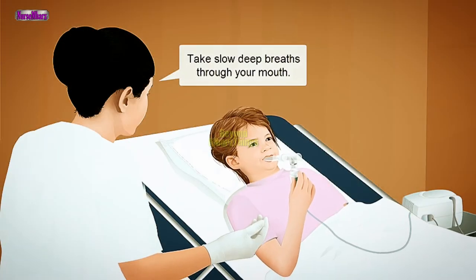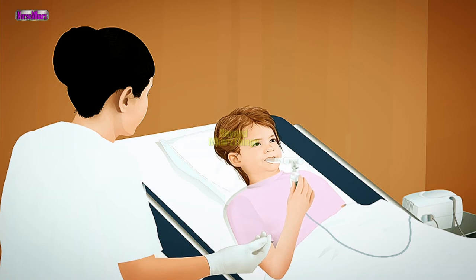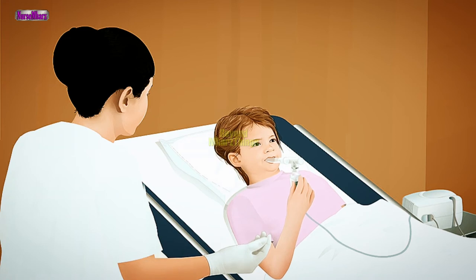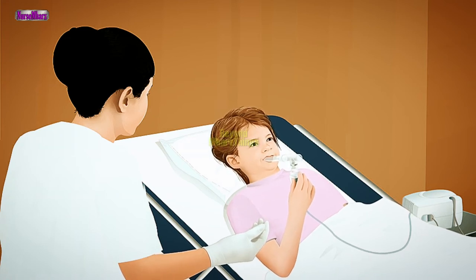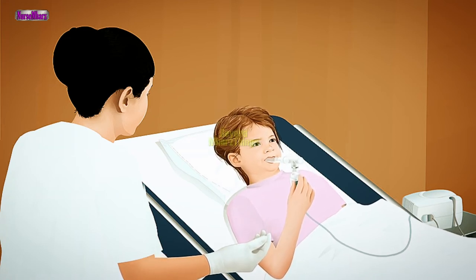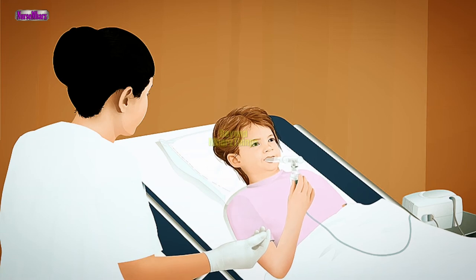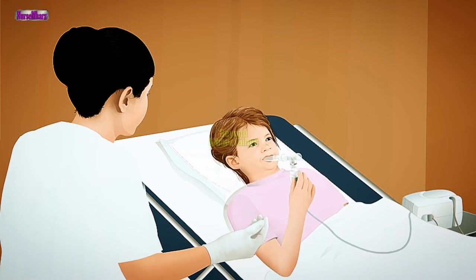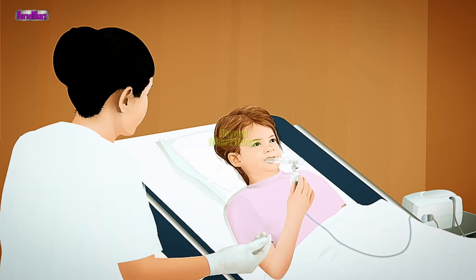Instruct the child to take a deep breath slowly, reaching an air volume slightly greater than normal. Encourage a brief end-inspiratory pause and breath holding, then have the child exhale passively.